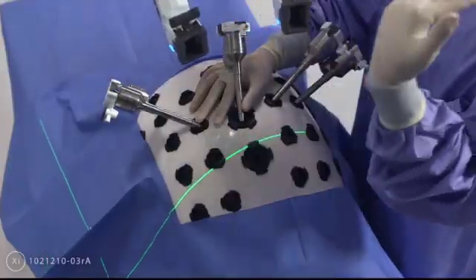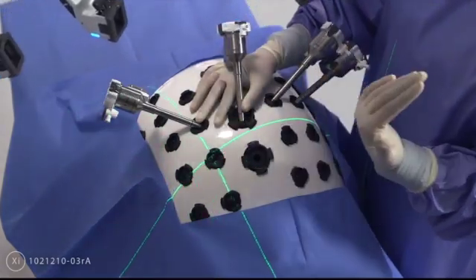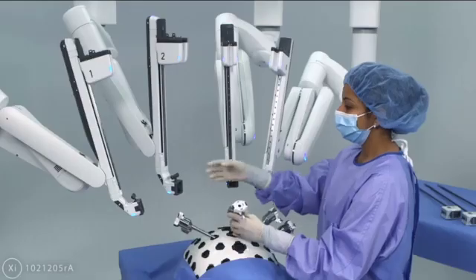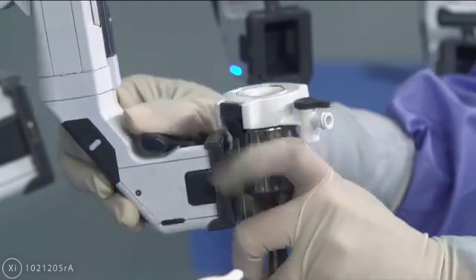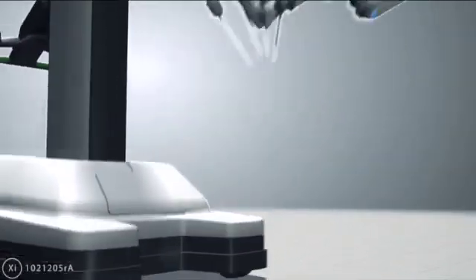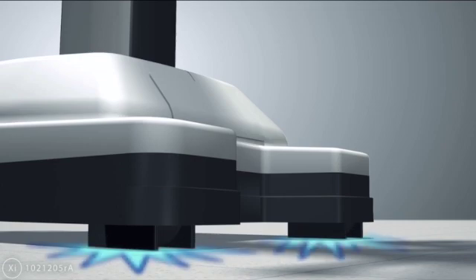Once the laser lines are positioned within 5 centimeters of the initial endoscope port, the initial endoscope arm can be docked to the patient. After the patient cart is in position, the sterile staff can continue the guided setup. First, a sterile staff member will dock the arm used for the endoscope to the initial endoscope port. Once the arm is docked to the cannula, the patient cart stabilization feet are deployed to prevent the cart from moving during surgery.